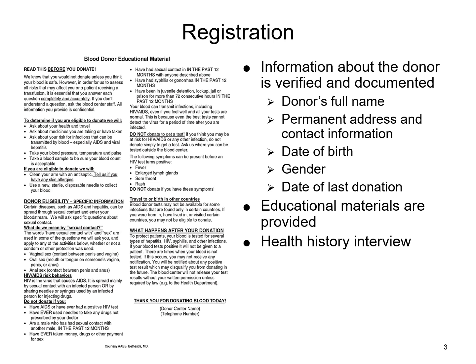Once a volunteer donor decides that they want to donate blood, there is a process that is followed in order to ensure that the product is the safest possible product that can be provided. In that process, you're going to have a step of registration. This is when the information about the donor is verified and all documentation is performed.